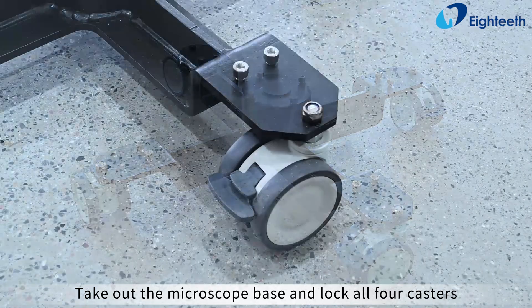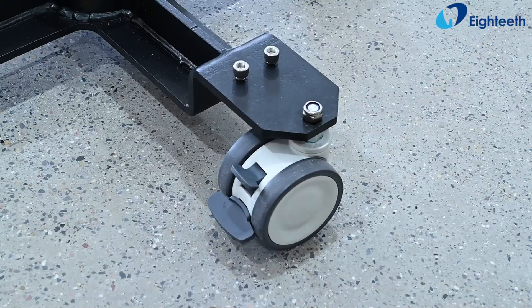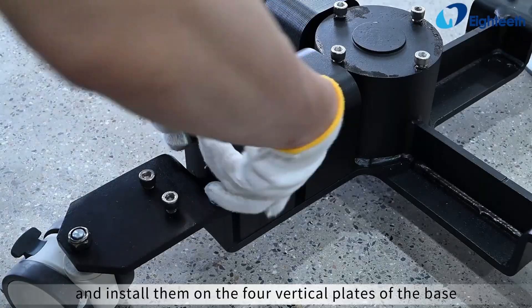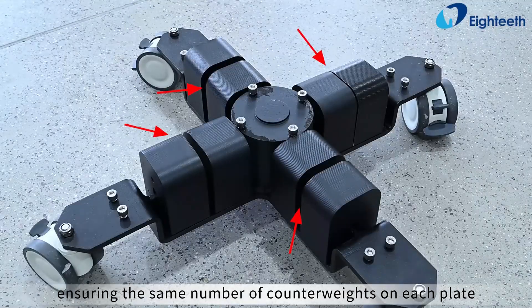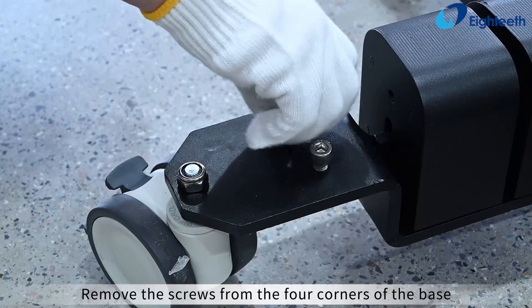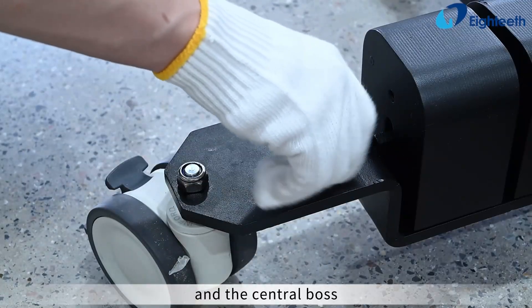Take out the microscope base and lock all four casters. Take out the counterweights and install them on the four vertical plates of the base, ensuring the same number of counterweights on each plate. Remove the screws from the four corners of the base and the central boss.